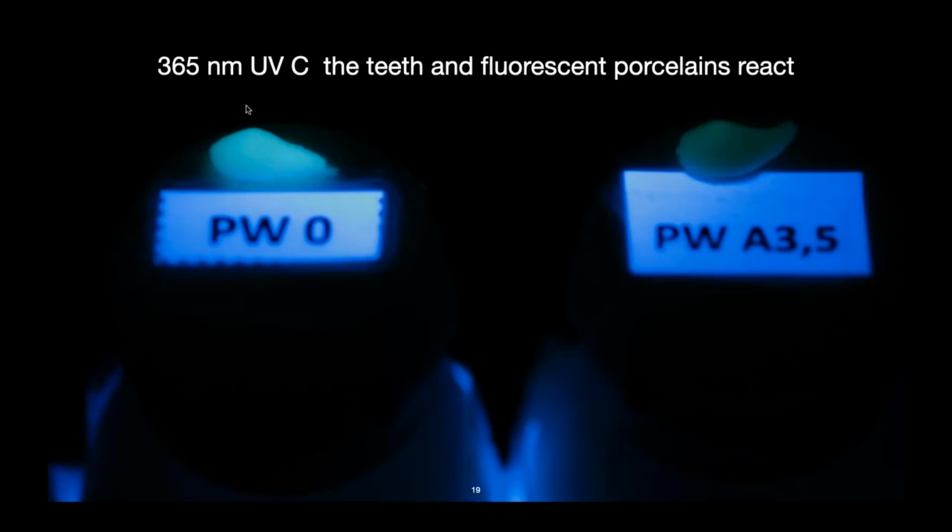This we already have in the Fluo Intense powders in the Lumex and the liners in the VM9. So if you have either one of those two powders, I like the white one on the lighter shades. Put a little coating on so you can actually see it. And you can put the light on it before you fire it, and you can see a dark spot if you didn't put enough powder on there. And so I covered enough so that it's like a miniature little wash, not a rough one, but real smooth. So it should encapsulate the coping.